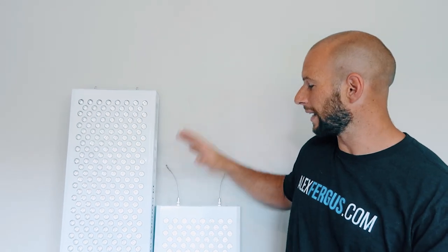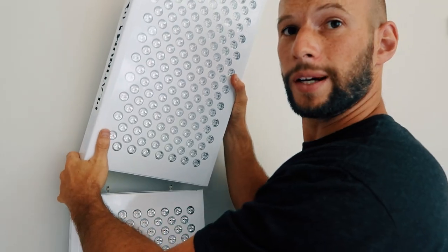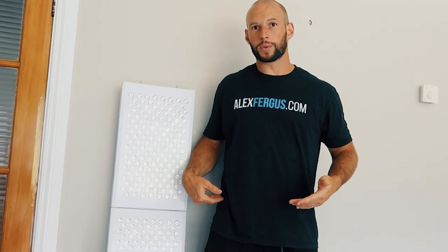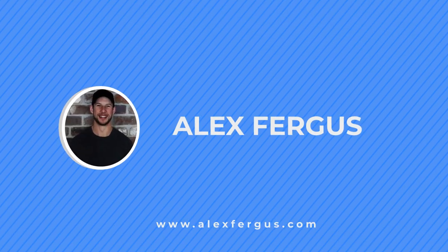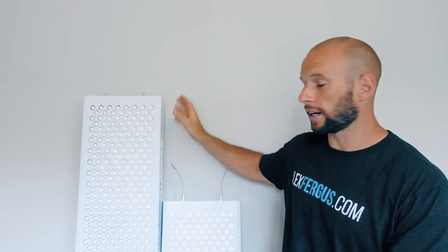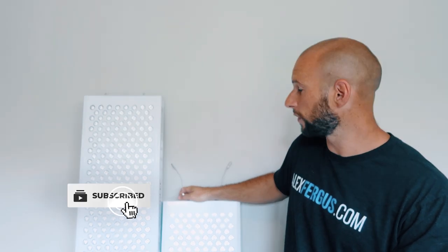Hello, it's Alex here from AlexFergus.com and today I'm going to show you how we can connect two Biomax red light panels together. Beside me I've got the Biomax 900, and then lower on the ground we have the Biomax 450.